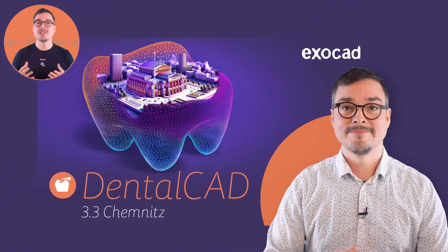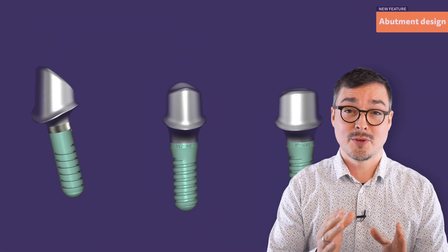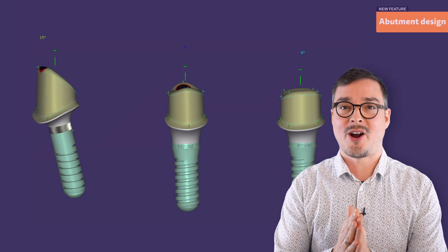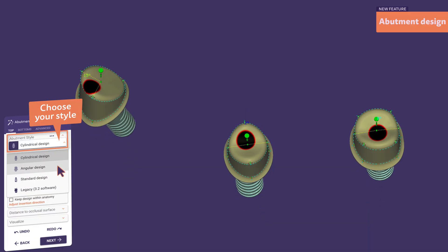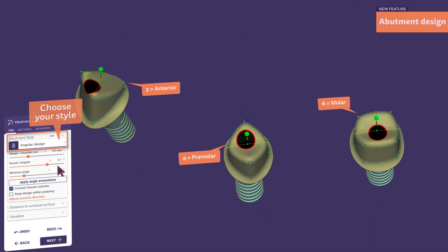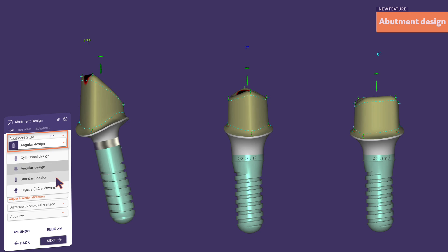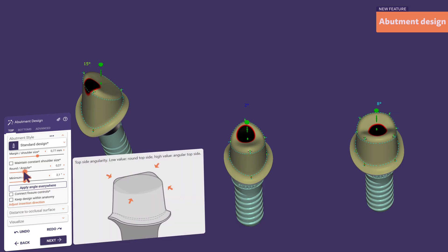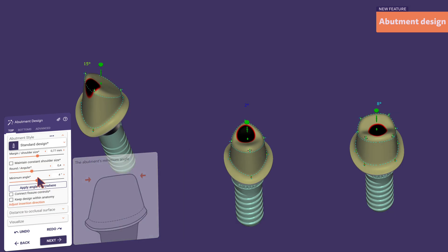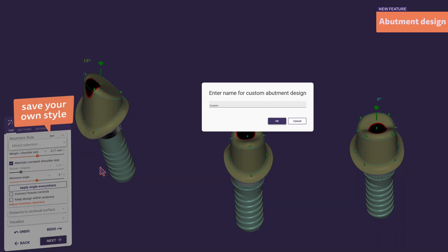The abutment design delivers remarkably good initial proposals to save time right from the start. Choose your favorite initial shape type and you're almost done — depending on the tooth, the control points are already pre-positioned for you. Let's choose the standard shape type and take a look at the intuitive sliders. Animated figures will guide us as we customize our abutment, and we can now save preferences as our own initial shape type.